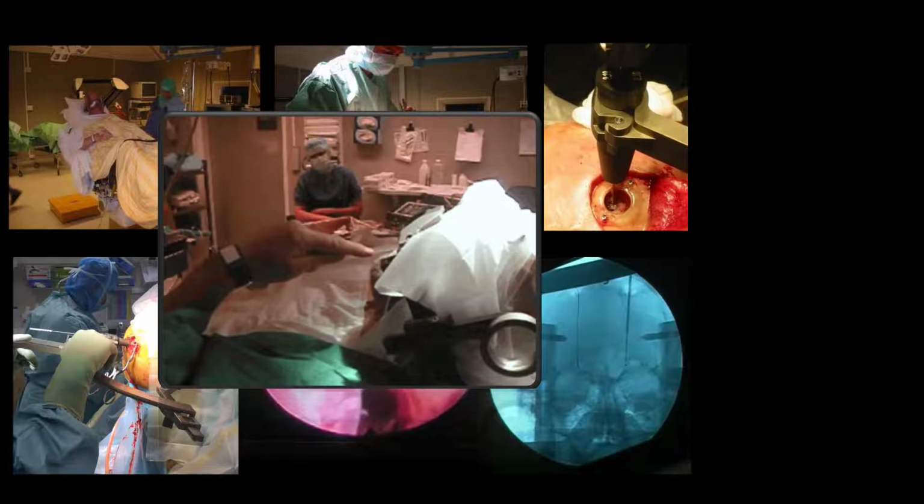Another way of evaluating if the electrode is in a good place is by using microelectrode recording, or MER, where you look at the activity of the neurons in your target to see if this activity is in accordance with what you would expect. However, nowadays I perform all these operations with the patients asleep and rely instead on an intraoperative X-ray investigation for confirmation that the electrode has ended up where I intended, and this is becoming more and more common around the world.